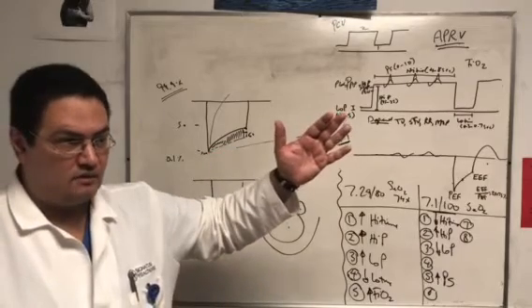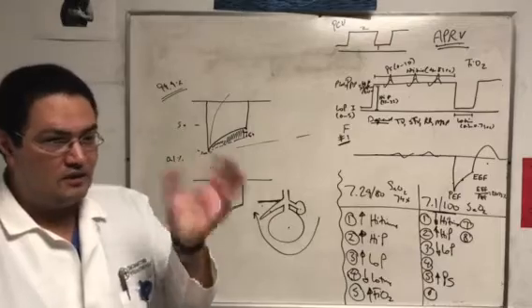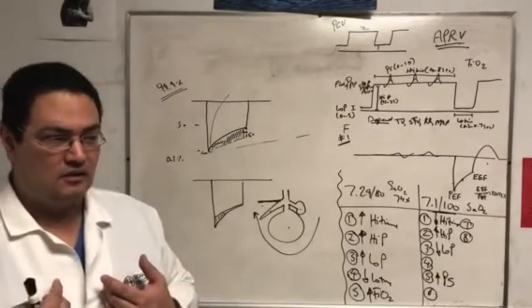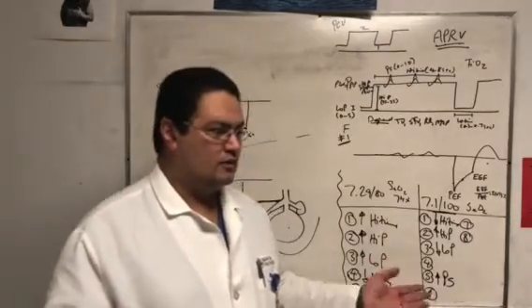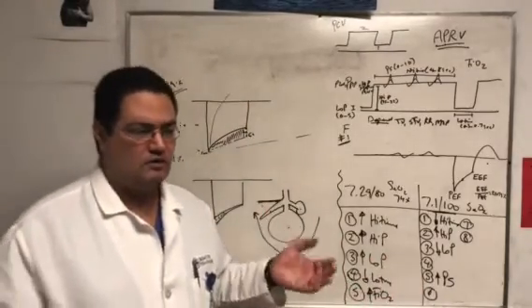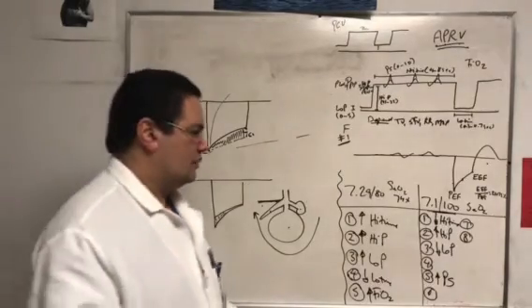That's a very, very small delta, so very small tidal volume. And for 14 seconds, I'm giving the patient only 4 breaths per minute, and they're very tiny breaths. The patient might feel that they are short of breath, just subjectively. So we can add pressure support to them. And it's not going to negate any benefit because the patient is improving anyway, right? So we can use that.